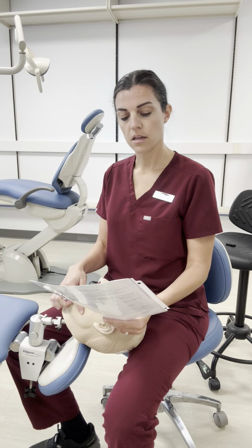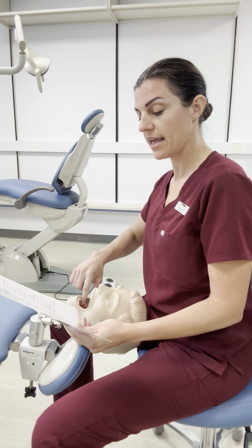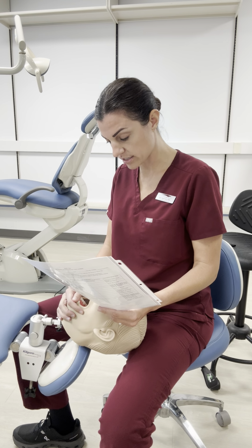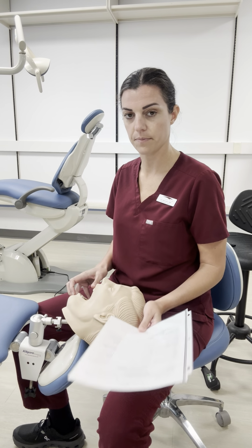Mandibular right lingual. Remember, that's towards the tongue side. We're going to be again in that 10 to 12 position, chin down, patient towards the operator. So the chin's going to be down and the patient is looking towards me. That way I can look directly into that lingual surface area.